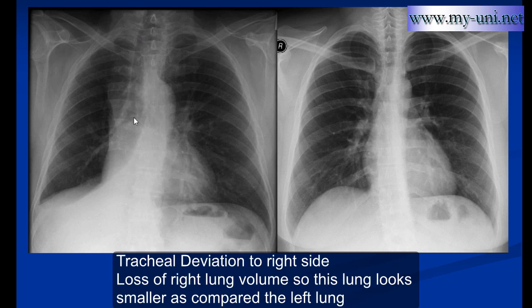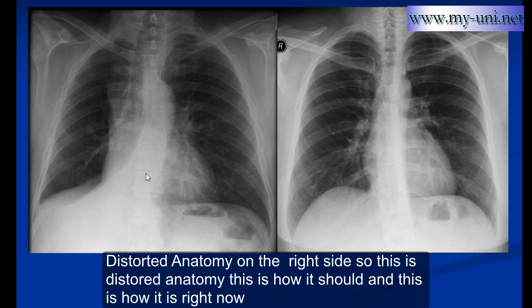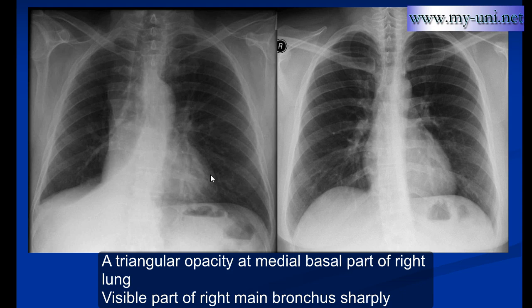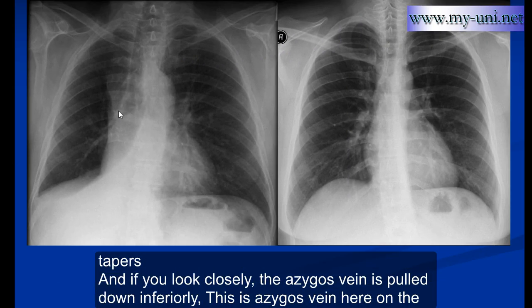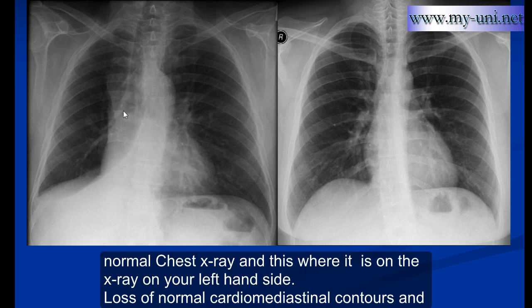Tracheal deviation to the right side. Loss of right lung volume — this lung looks smaller compared to the left lung. Distorted anatomy on the right side. A triangular opacity at the medial basal part of the right lung. The visible part of the right bronchus sharply tapers. And if you look closely, the azygos vein is pulled down inferiorly. This is the azygos vein on a normal chest x-ray, and this is where it is on the x-ray on your left hand side.